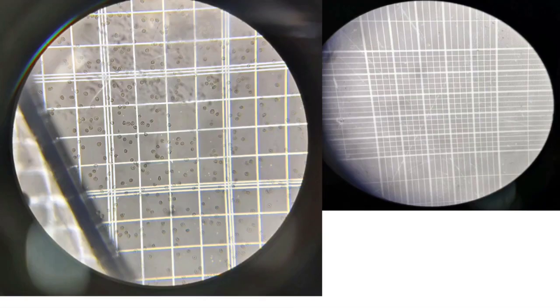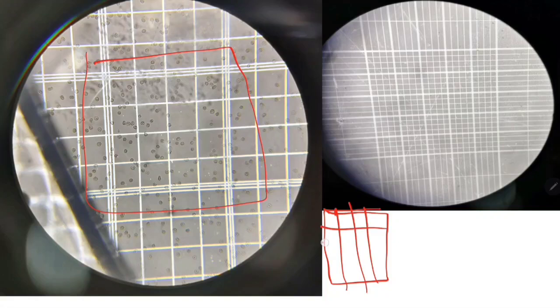Now let's move to the next part, the counting part. Here we have cells, so let's start counting. So we have to make 5 boxes here. Suppose this is one, this is a triple line box, this box. So here we have to make 1 2 3 4, and suppose this is the first box. Here the middle line is the reference line, so this cell is touching the middle line, so we'll count 1, 1 2 3 4 5 6 7, and we can consider 8. So suppose 8 is here.